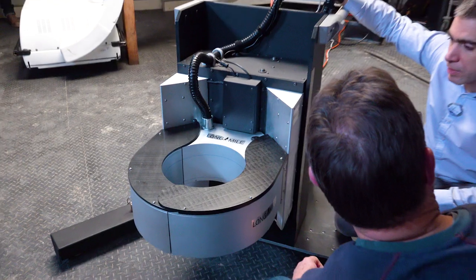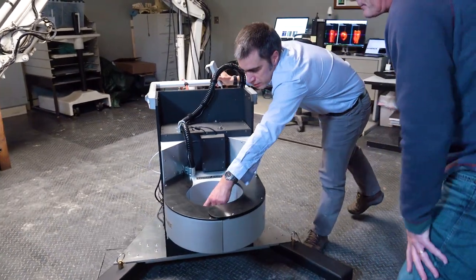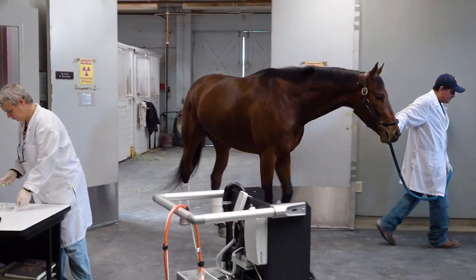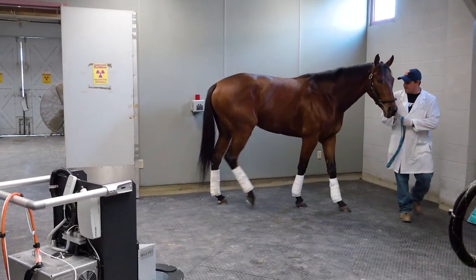That was very exciting and the results of that study were well received, but the main limitation was the need for general anesthesia. The concern was that with the full ring, it was too dangerous to put the horse's limb in there if the horse was to move. That's why we came up with the design of an openable PET scanner.